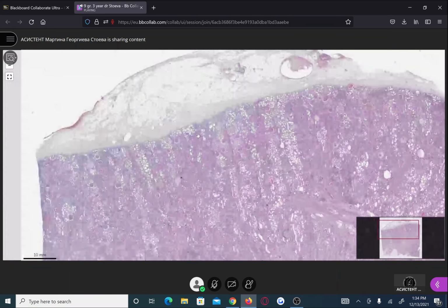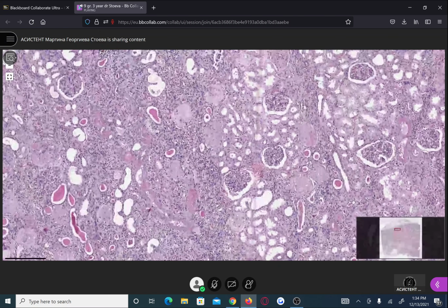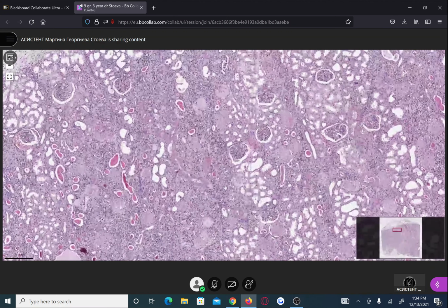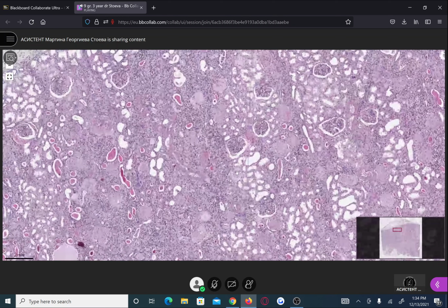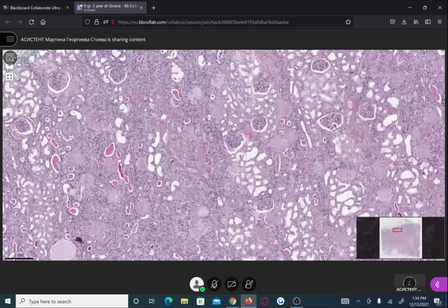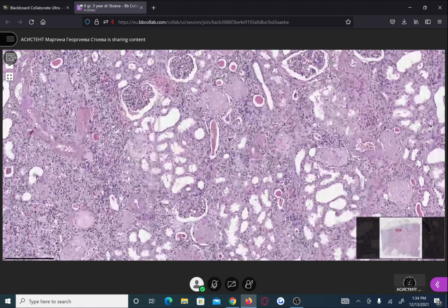And now the pathologic process. I think that at low, medium magnification, but not the low one, in between the normal glomeruli, or a little bit hypertrophic ones, we can find some others that look like small pinkish balls. Note that they are smaller than the normal ones and they are completely hyalinized. Here again.